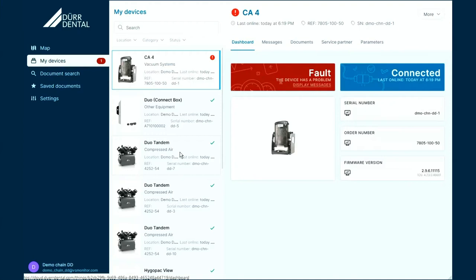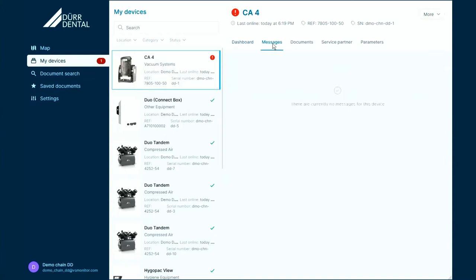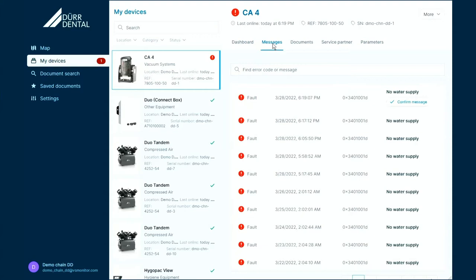For each device, we offer a short dashboard which gives you the key insight of the status and also information of the device operation. Any messages that the device delivers are collected here in this message history with the severity and a short description. Some messages can even be confirmed remotely, for example, in the separator or also the emergency mode in a compressor.